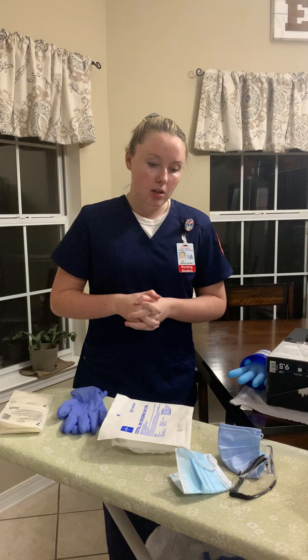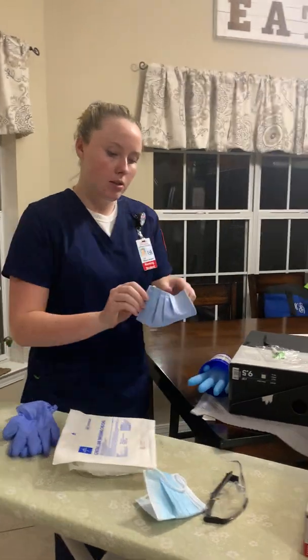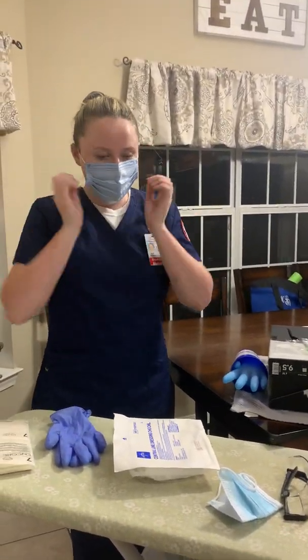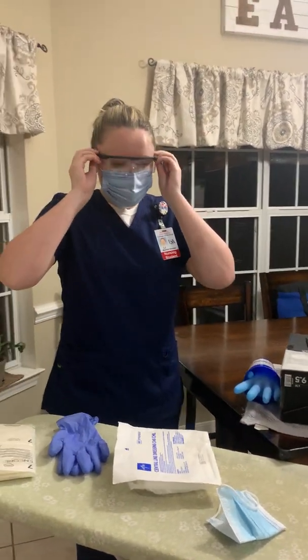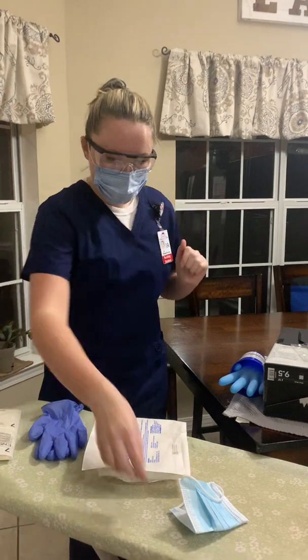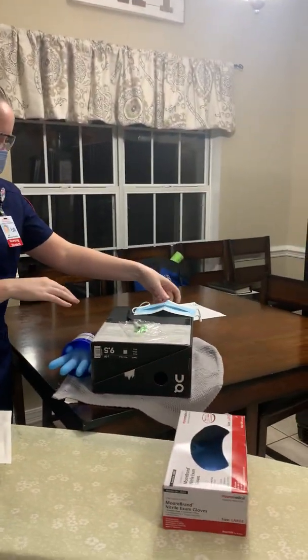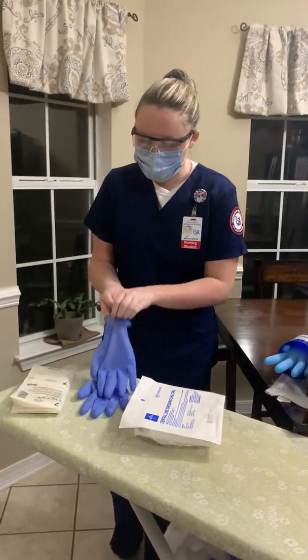Okay, so the next thing I'm going to do is put on my goggles and mask, as well as my patient's mask. So I'm going to go ahead and put my mask on first. And then my goggles. And then my patient's mask. And my patient's face would normally be right here on top of the central line, but for today's purposes, this is how it's demonstrated. And then I'm going to put on my gloves.